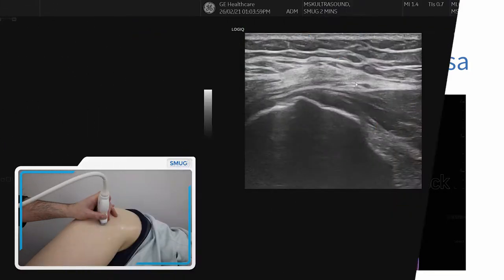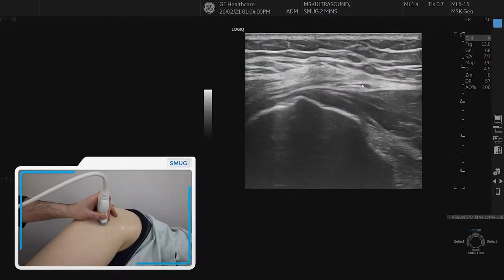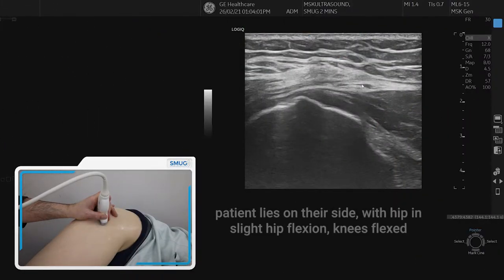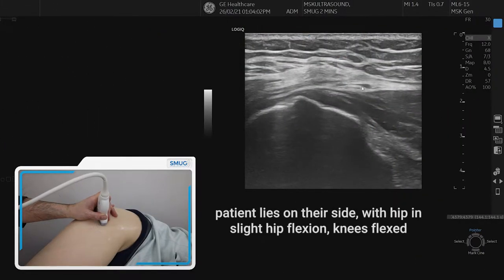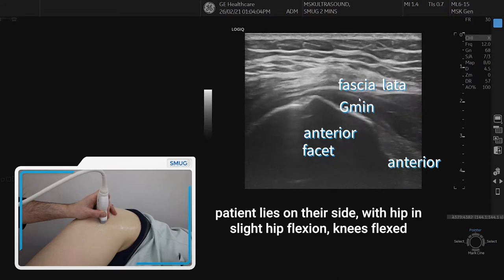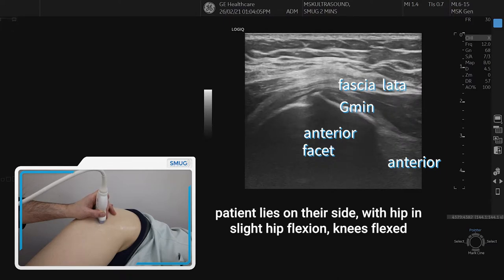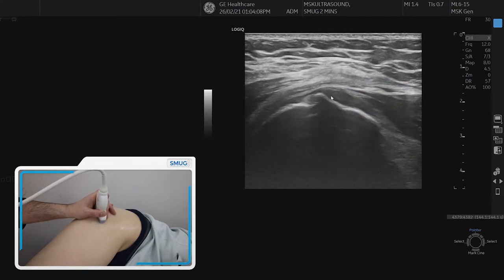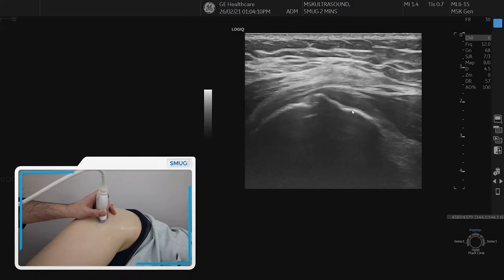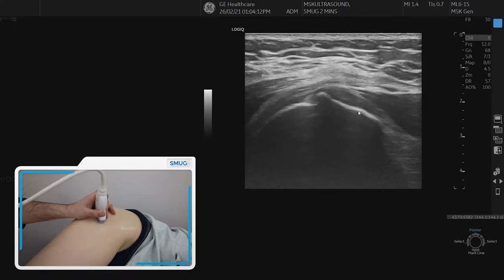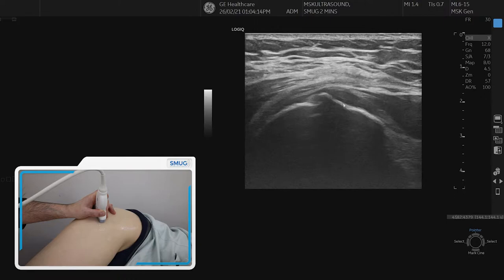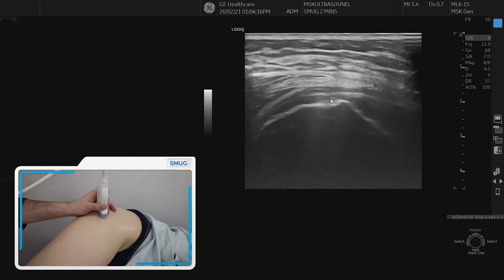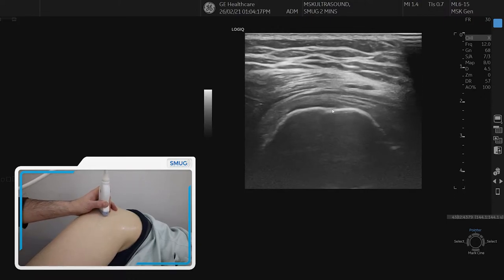Now let's go to the more superficial layer around the greater trochanter. What we have already gone through in the previous video is the glute minimus and medius tendons. So just a brief reference to them: the anterior facet of the greater trochanter with the minimus on top. Go to the lateral aspect.